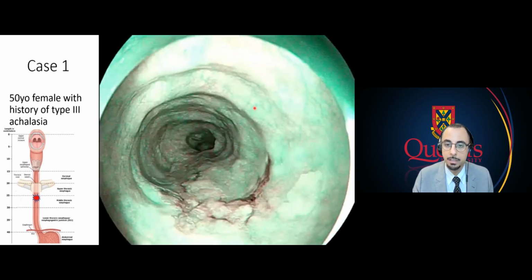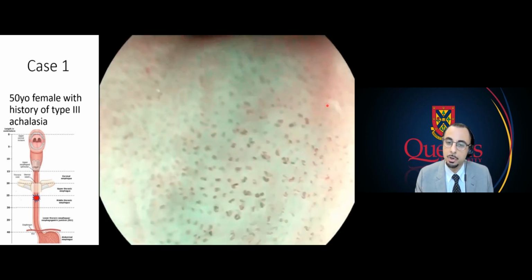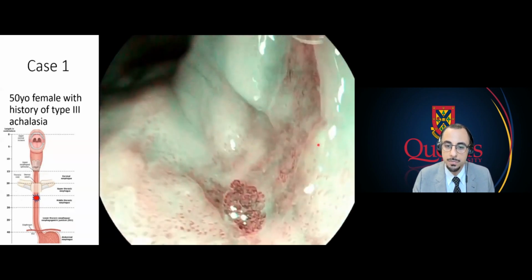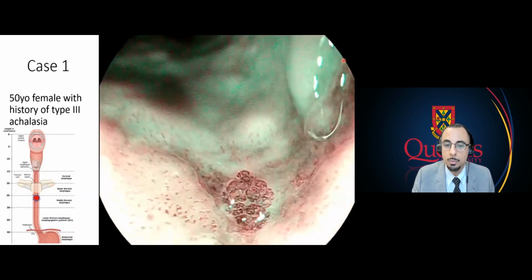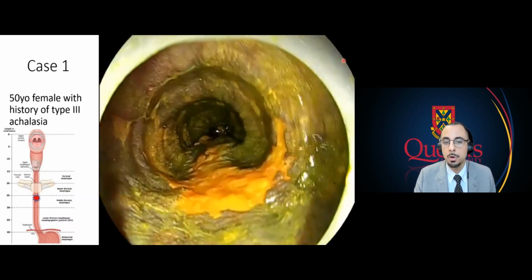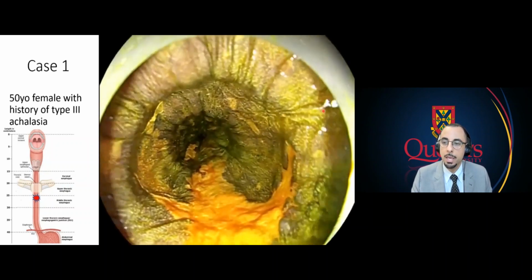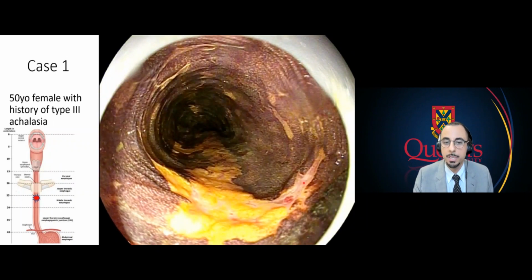This particular light helps highlight the vasculature, which is the earliest thing that changes with squamous carcinoma. And you can see these vessels here with this light are really well highlighted. We can also use Lugol's, and Lugol's basically stains normal squamous mucosa this dark mahogany color, and dysplastic lesions are Lugol-voiding lesions, and they appear as orange, or if you wait a bit longer, they can turn pink. It's usually indicative of carcinoma.